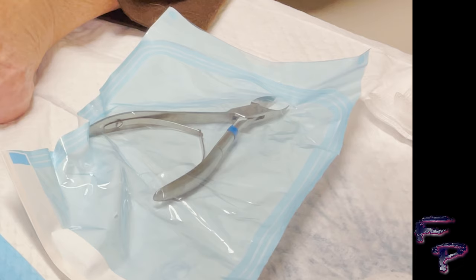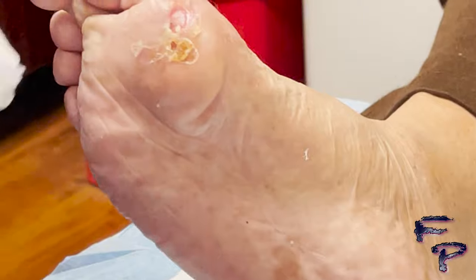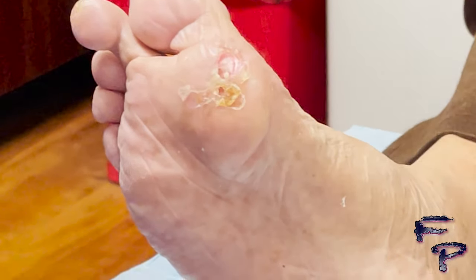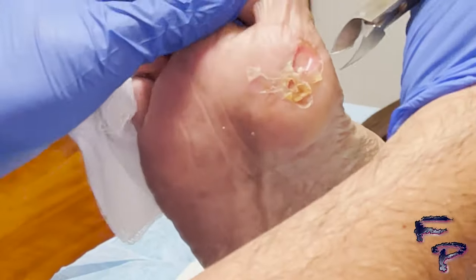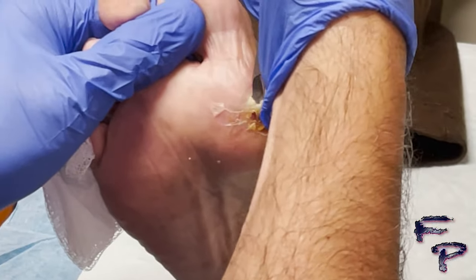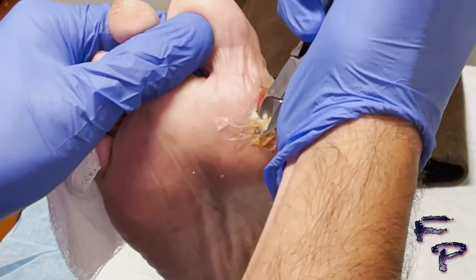The main tools I will be using are a tissue nipper, a number 15 blade, and a curette. There is a loose amount of tissue around this ulceration which I will slowly but surely remove utilizing these tools.